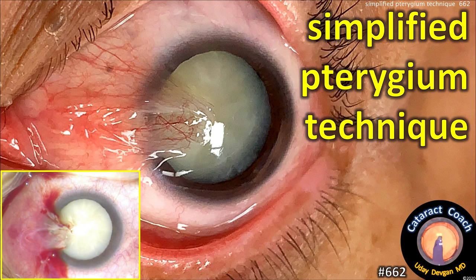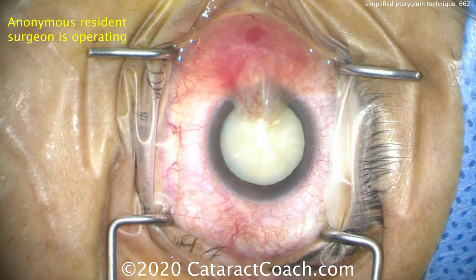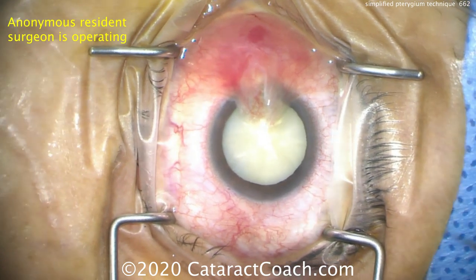CataractCoach.com simplified pterygium technique. Look at that picture — this patient has a very significant pterygium encroaching on the visual axis, also a dense white cataract. We've got to help this patient.